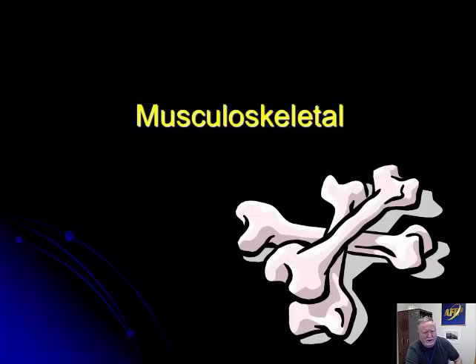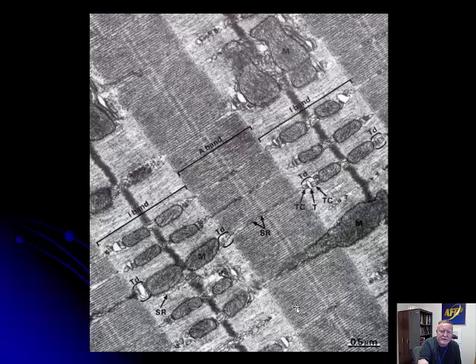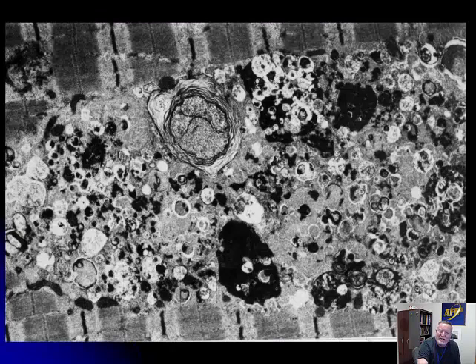Musculoskeletal system — we've covered muscle pretty well. Z-bands or Z-discs, sarcomere, actin and myosin filaments, and when this muscle contracts you're going to get these squeezed in. Everything is in register, so you shouldn't have any trouble recognizing skeletal muscle.